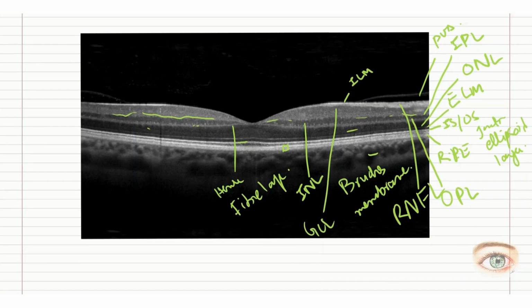A very good tip for you guys is to read an OCT scan every day so that you can memorize these layers, and also so you can see any abnormality or any dysfunction happening in these layers. So that's it for today. I hope I have made everything clear.